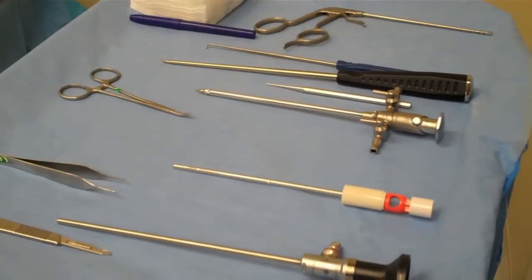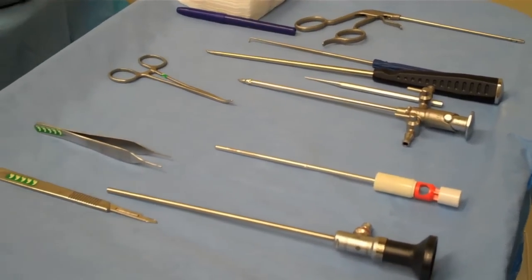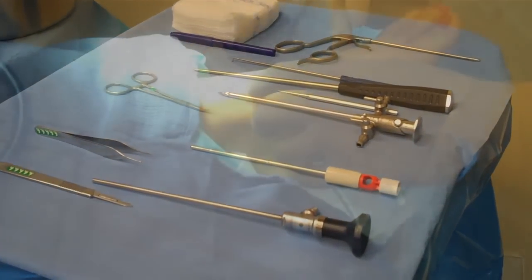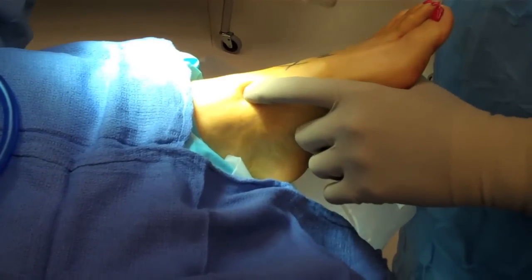Ankle arthroscopy. This is a basic tray setup for an ankle arthroscopy with an obturator, shaver, cannula, and arthroscopy scope.